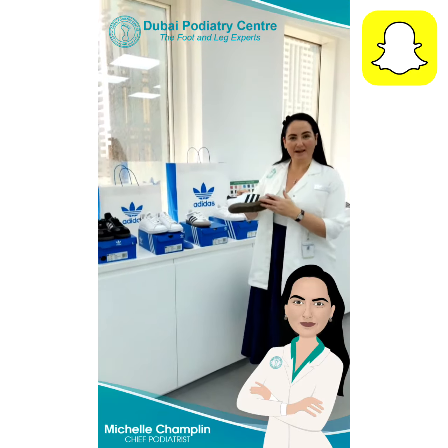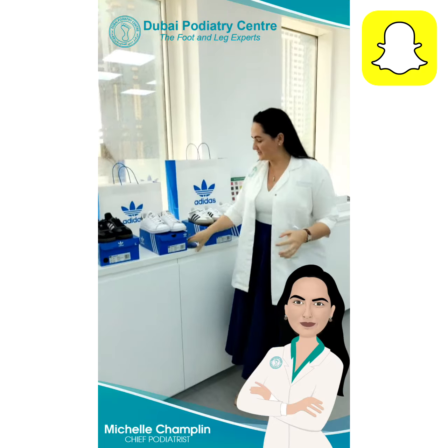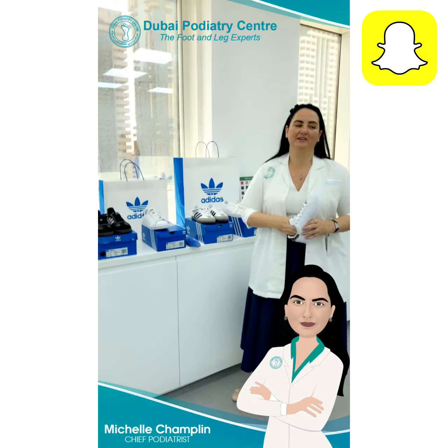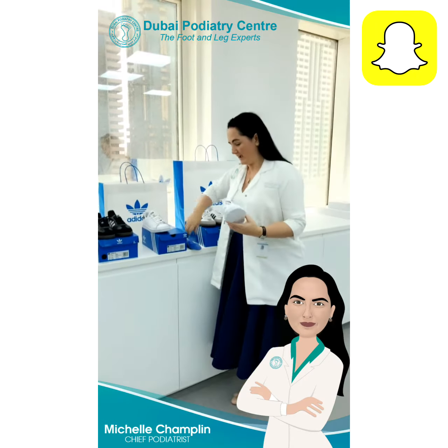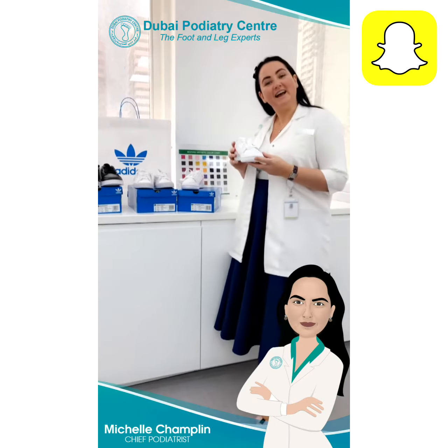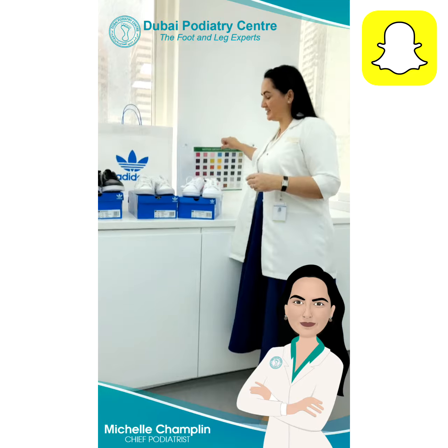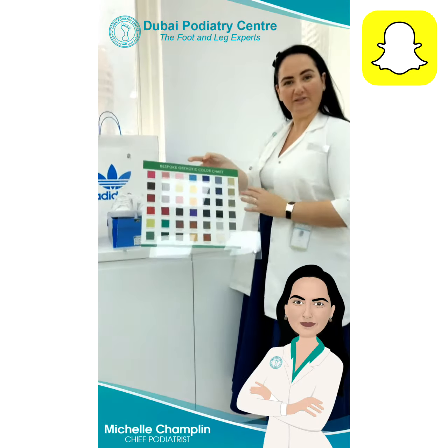These are the shoes we recommend from Adidas — they have a very strong sole. If we are going to put an orthotic inside the shoes, we ask you to remove the insole. This shoe has a very nice insole; we remove it and then your orthotic can sit inside perfectly. These are the Adidas Continentals and they all come with a different color double stripe at the side. When you have an orthotic, you can color-coordinate the orthotic color with your stripes.